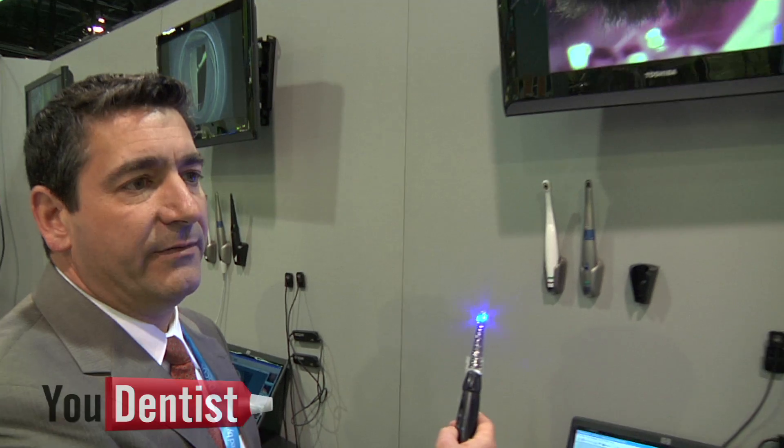The other setting this camera has is the diagnostic mode — the caries detector. I'm going to put this on my molar and what you're going to see is the cusps of my tooth will be light blue and the interior will be green. The blue indicates good enamel and the green indicates good dentin.